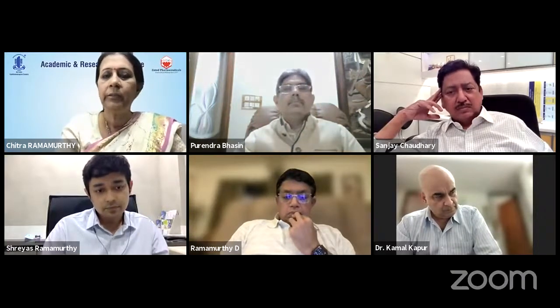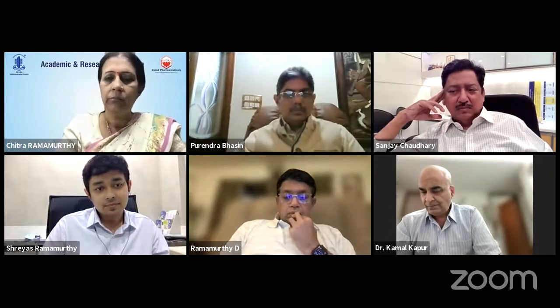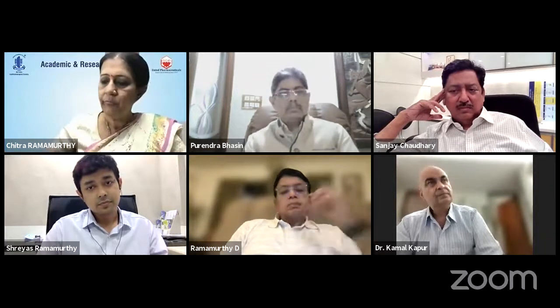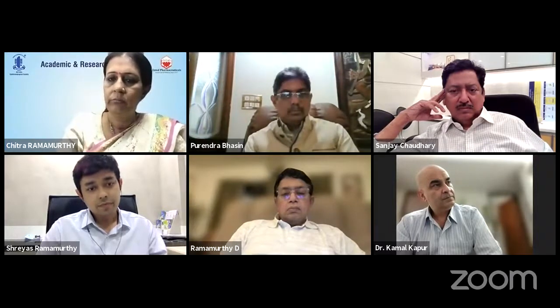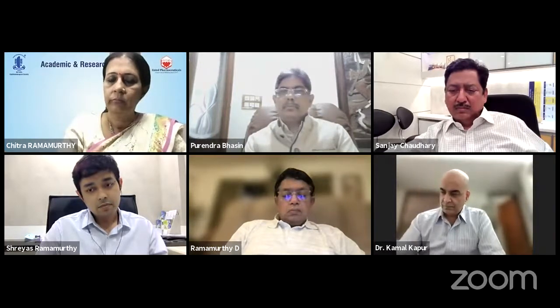If I may just put in a comment, my video is not working again, like Anaga's. I had tried to do a study on that, and we tried to see if the lens rise is significant as far as sizing of the IOL is concerned, just to prevent a low vault or a high vault. And we went to STAAR with it, and I had talked to one of their clinical applications people when we had gone for one of their conferences abroad, and she said that they had already done a study, and they found that lens rise is not significant.